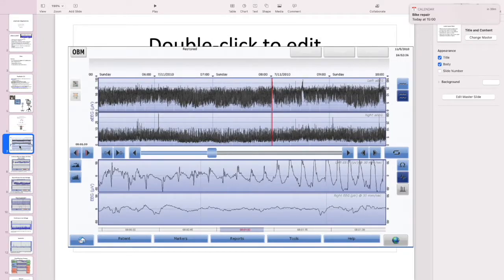So aEEG is actually really quite simple. There are only 5 main classifications of background activity, and then on top of that you can identify seizure. There is a little bit of a problem because aEEG was originally developed for adult intensive care after cardiac arrest, but is routinely used in neonates.